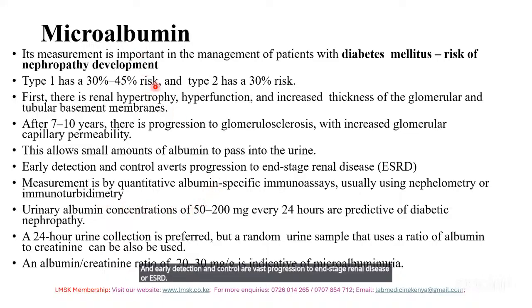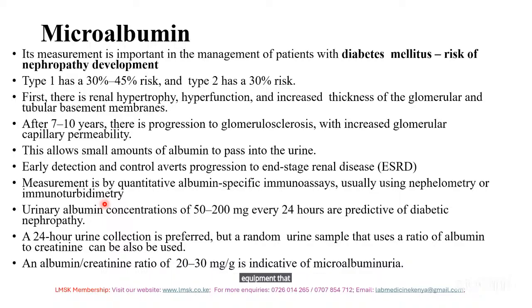Measurement of microalbumin is through albumin-specific immunoassays, which usually use nephelometry or immunoturbidimetry. There is even point-of-care equipment that does microalbumin. And then also urine creatinine levels.